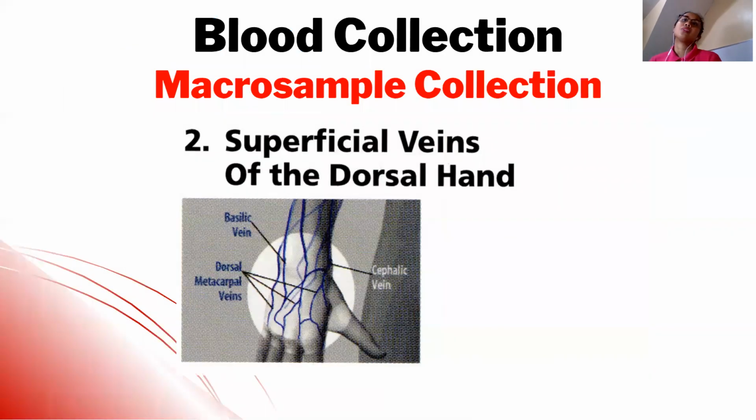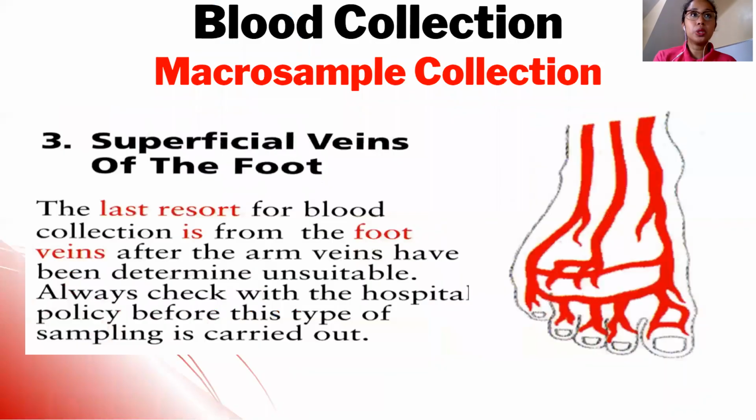Okay? Yan. So, superficial veins of the hand. So, dapat mababaw lang to. Yan. Tapos, maliit yung needle na gagamitin mo. Yan. Tapos yung gauge, superficial veins of the foot. Yan, always check with the hospital policy, if it's allowed.